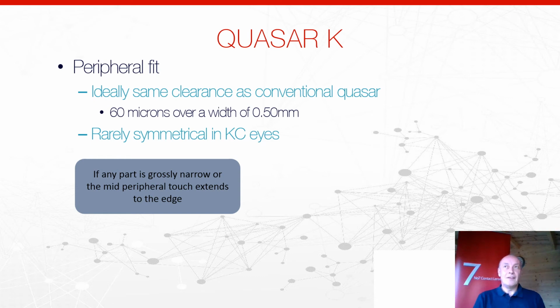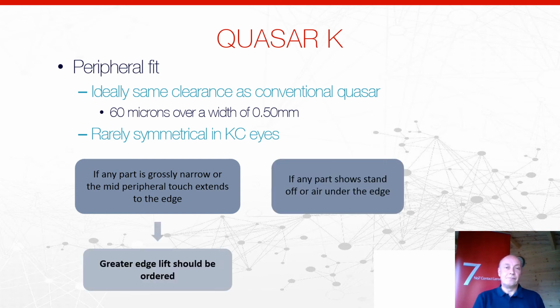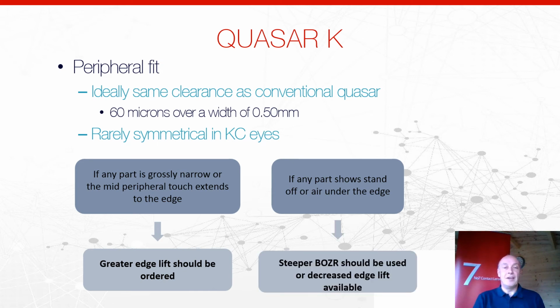If you find that it's fitting very narrow or tight and that extends out to the edge, then increase that edge lift. If there are any areas of stand-up or you're seeing bubbles being formed underneath the edge of that, then reduce that edge lift.